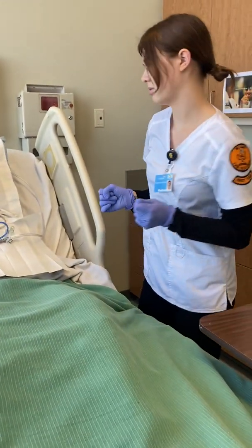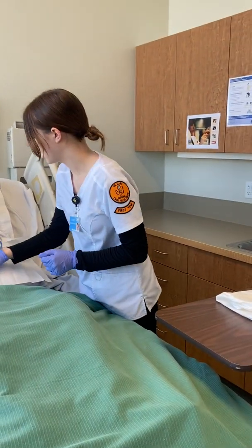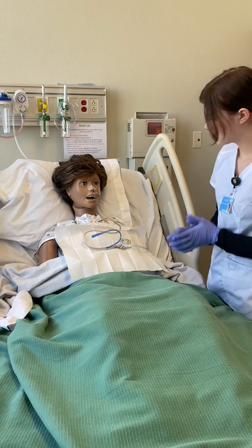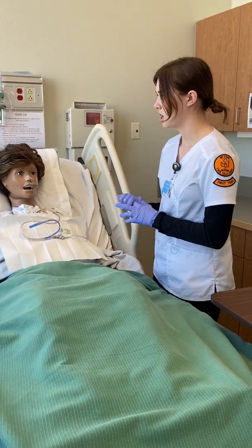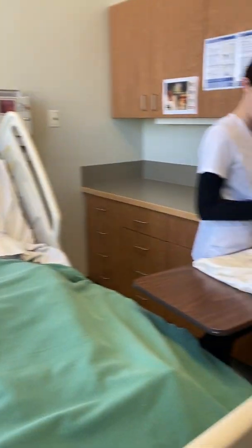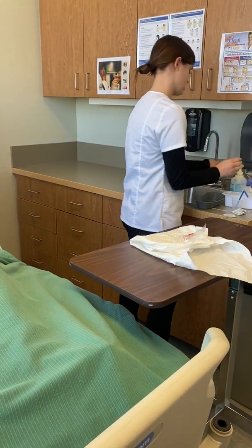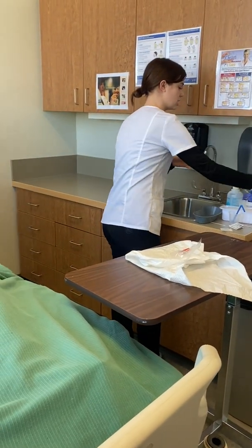And normally this isn't for a long amount of time, it's just a short-term thing. All right, doing okay? Probably feels a little bit weird. All right, I'll be right back. I'm gonna clean up the rest of my supplies, and then I'll be right back, and then we can turn that suction off. Wash my hands again. On a new pair of gloves.